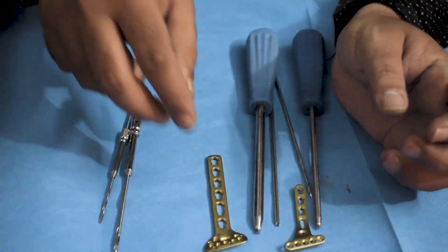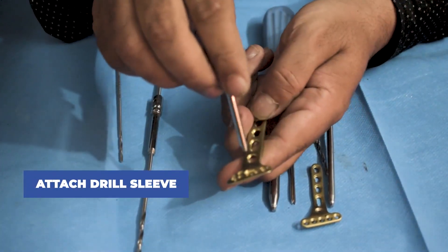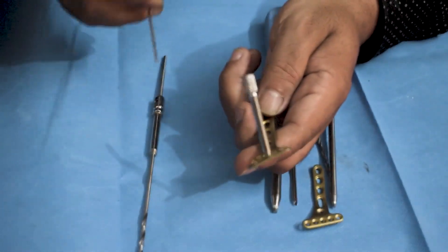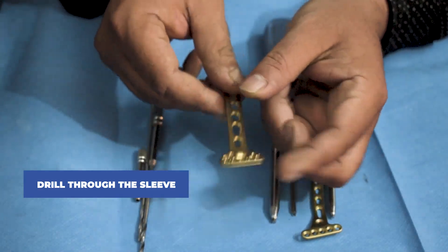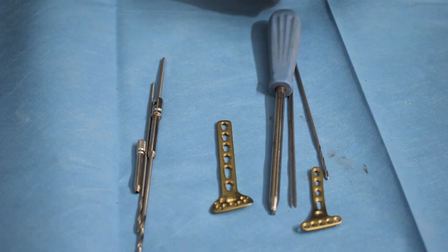To fix this plate at the fracture site and attach a locking screw, first we have to attach the drill sleeve. After that, drilling is done through the sleeve, then we remove it and attach the screw.